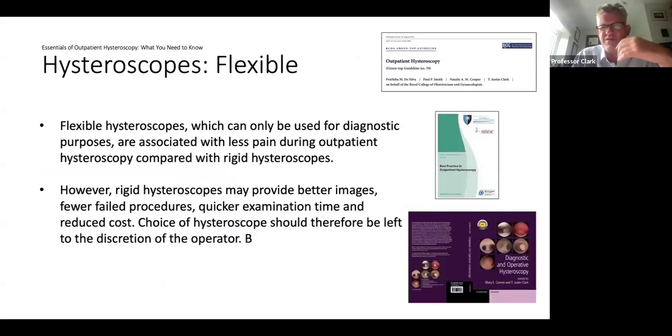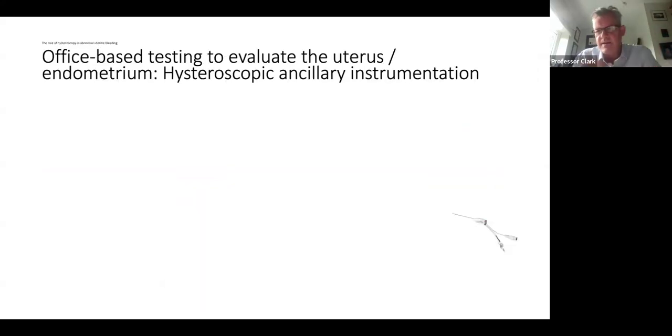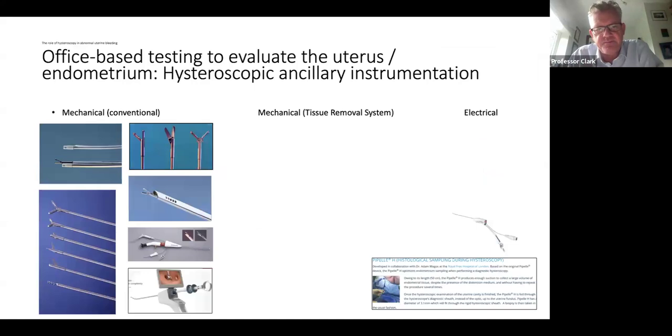Flexible scopes are available, but we don't tend to use them now. Certainly in the UK, they're very rarely used, simply because they can't really offer operative procedures. And they require high-level disinfecting rather than sterilization. So generally, they've gone out of fashion really in hysteroscopy.